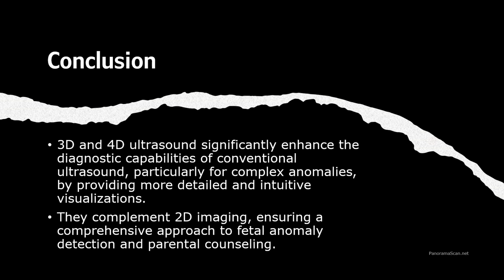They also play a crucial role in parental counseling, offering a clearer understanding of the fetus's condition and helping parents make informed decisions. While 2D ultrasound remains a vital tool, 3D and 4D ultrasound complements it, ensuring a comprehensive approach to fetal anomaly detection and ultimately improving prenatal care outcomes.